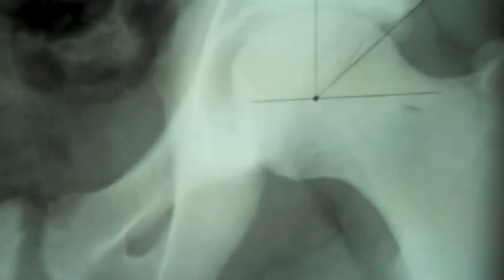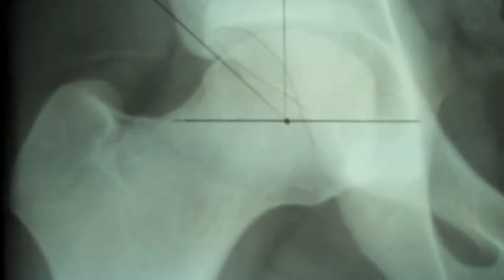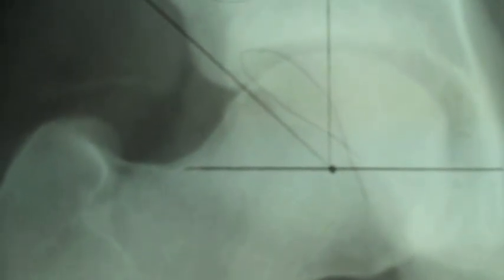This is drawn as a line connecting the femoral center of rotation hip to hip. A perpendicular is drawn through this point, and then a second line is drawn from the center of the head to the rim of the acetabulum. This allows measurement of the center edge angle, which in this patient approximates 50 degrees.